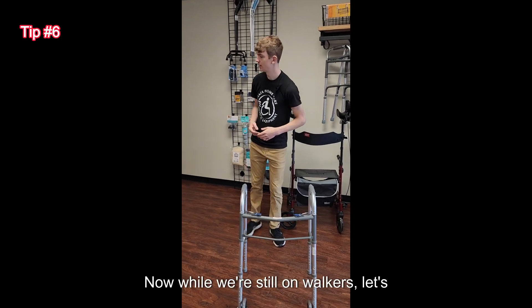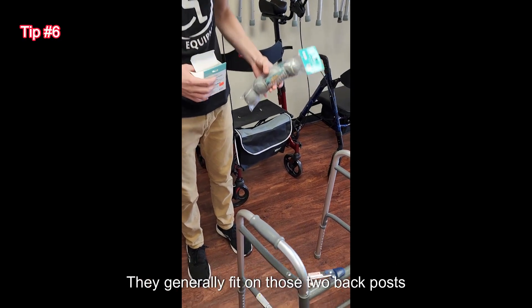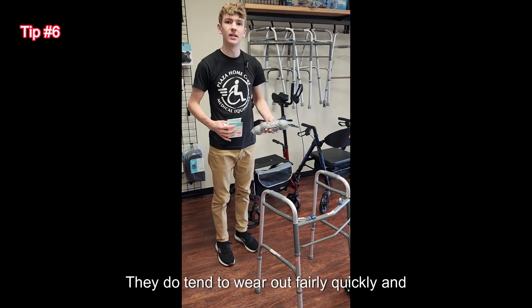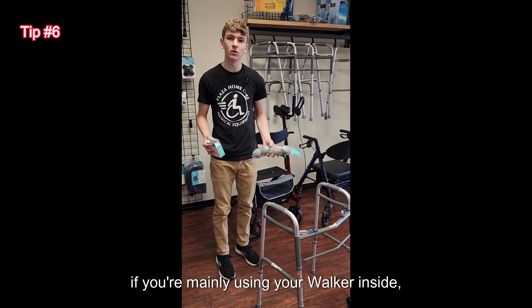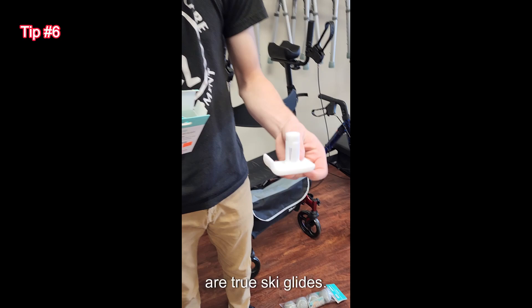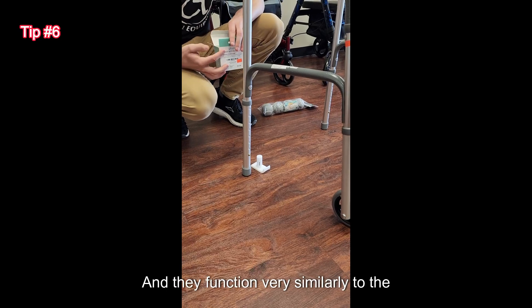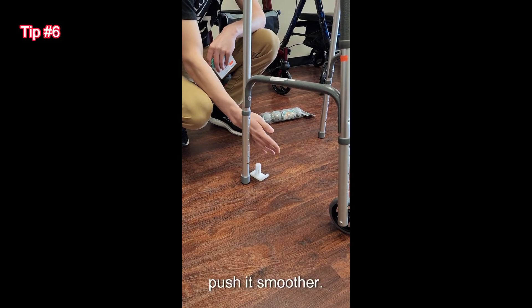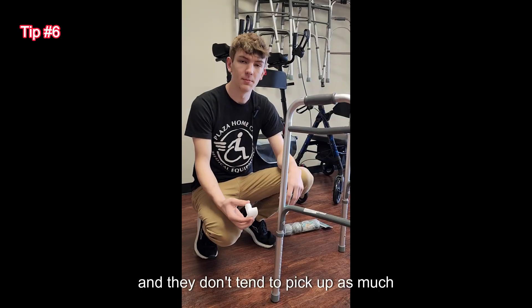Now while we're still on walkers, let's talk about tennis balls and ski glides. Tennis balls generally fit on those two back posts of your walker and help provide a smoother ride. They do tend to wear out fairly quickly and generally pick up some debris from inside; however, if you're mainly using your walker inside, these are a great solution. Ski glides fit in those back posts and function very similarly — they allow you to push more smoothly, are a bit more durable so they don't wear out as quickly, and they don't tend to pick up as much debris.